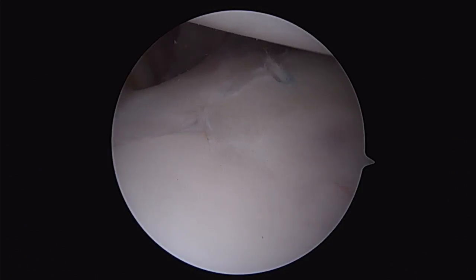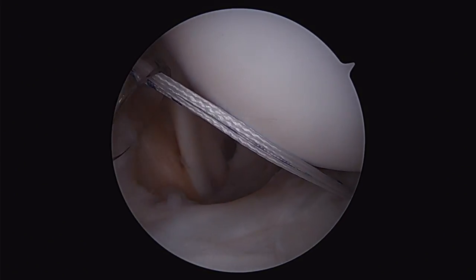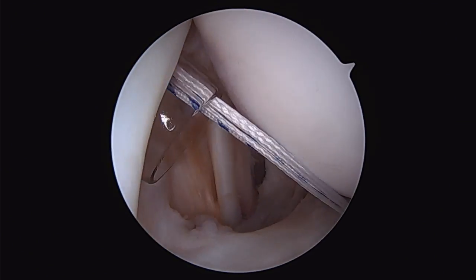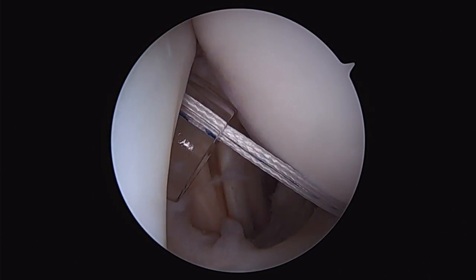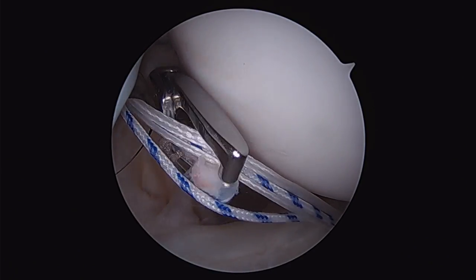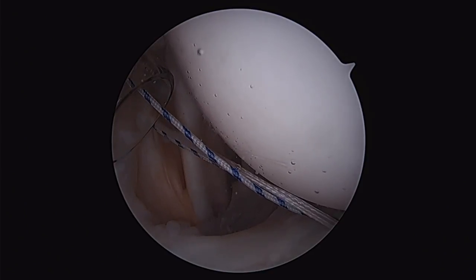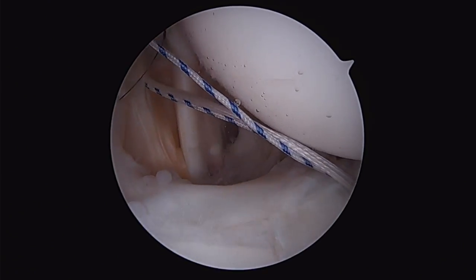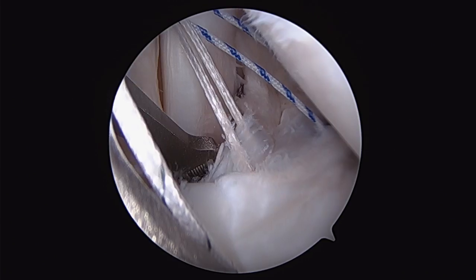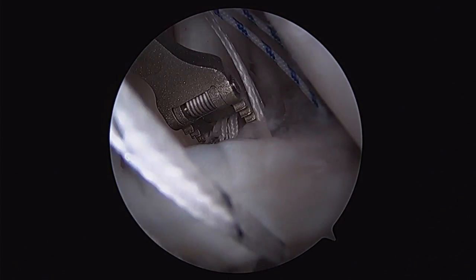In this very patulous capsule, this is going to allow us to repair both the capsule as well as the capsulolabral complex. We retrieve our sutures, shuttling them out through an accessory portal. Then we pass our sutures to the inferior glenohumeral ligament and labrum, then to the most superior aspect of the middle glenohumeral ligament and labrum, and lastly we place another one around the labrum itself.